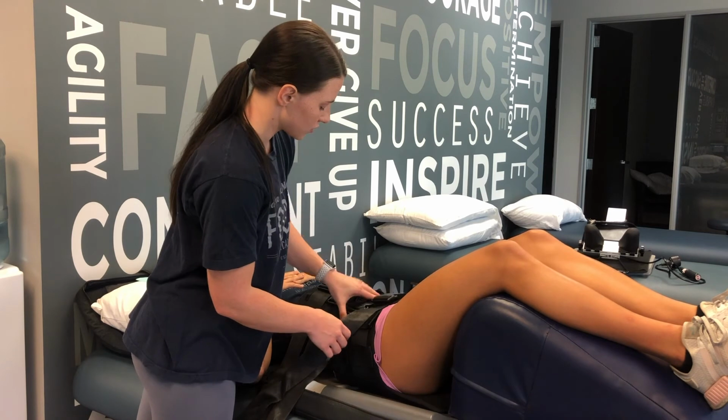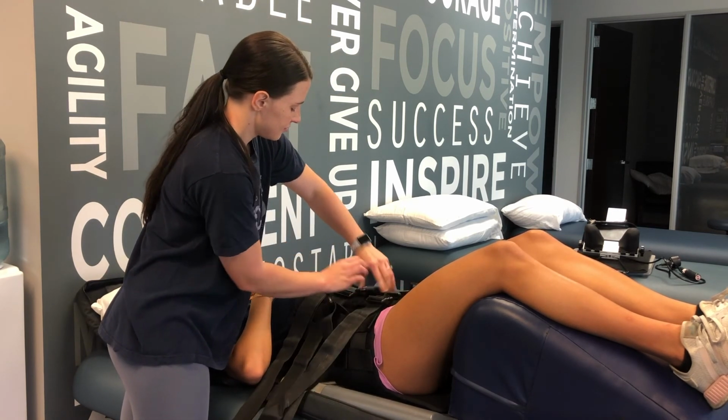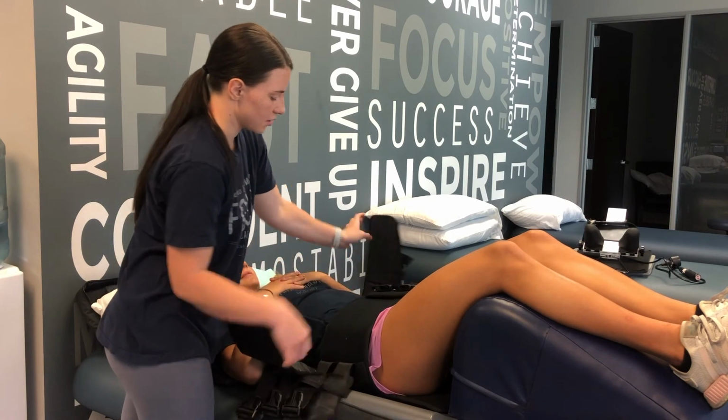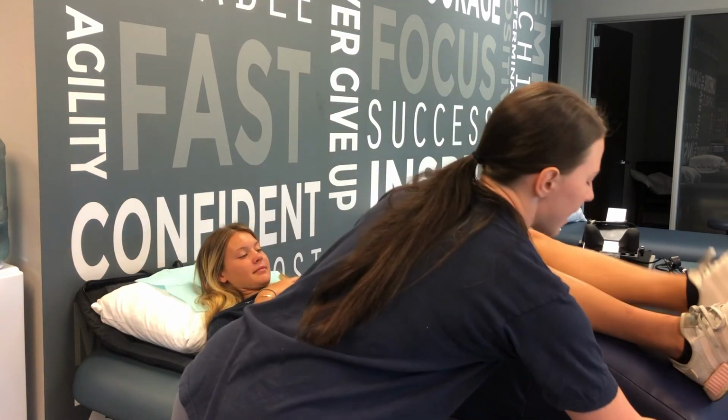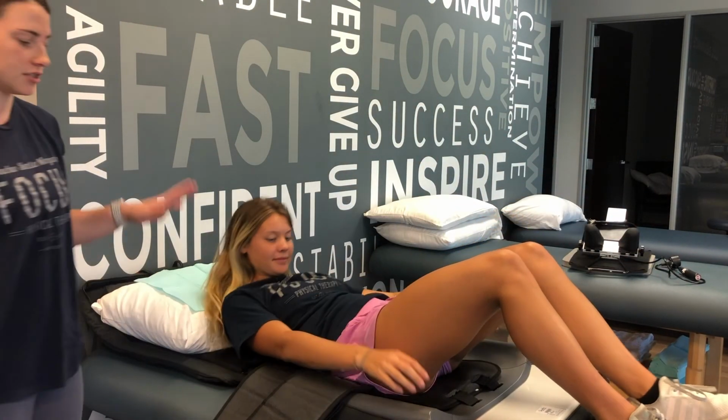We'll undo the buckles. Make sure they can breathe. And then we can let them out. We'll take the bolster out. And then I always advise people to just kind of sit on the edge of the traction for a second just to get their wits back. Sometimes it can make them a little dizzy. Make sure there's no discomfort. If they did have discomfort, relay that to the therapist.